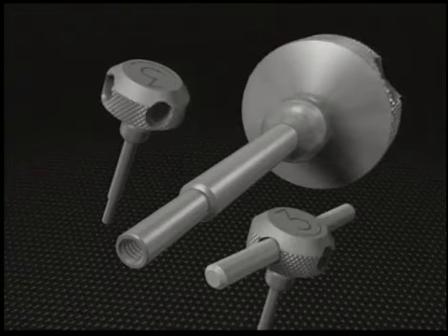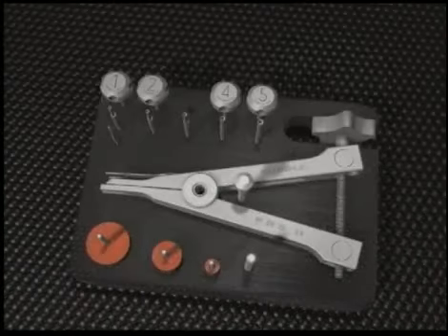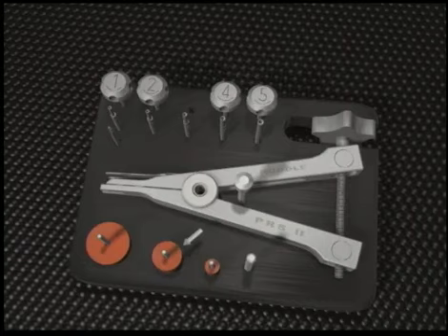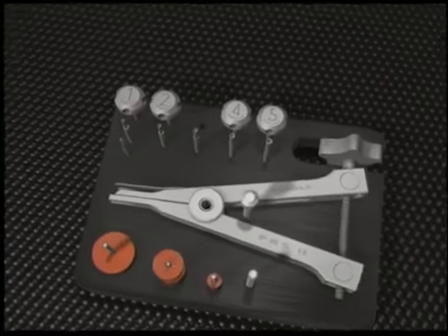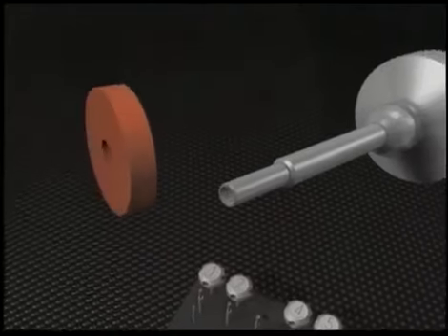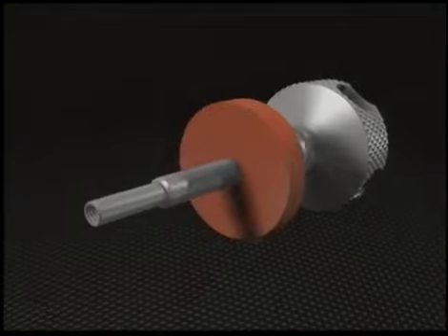Additionally, a torque bar can be inserted through the handle port for added comfort and leverage when removing a large post or an actively engaged screw-type post. A silicone cushion is selected such that it will not be displaced into the access cavity and will distribute the post removal loads evenly over the biting surface of the tooth. This bumper is placed over the working end of the tubular tap.